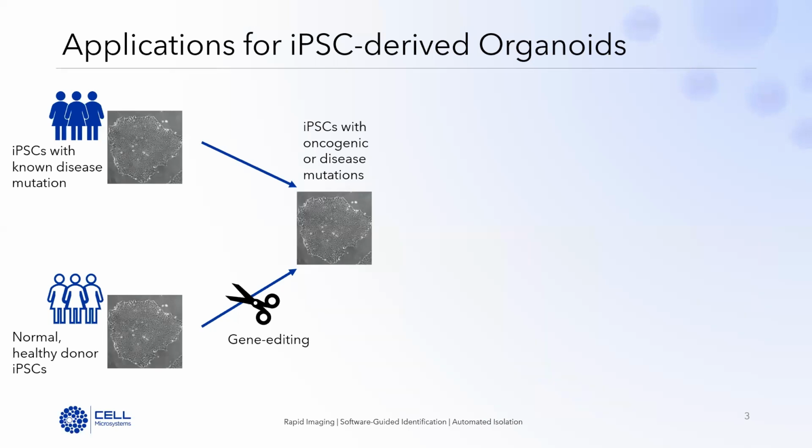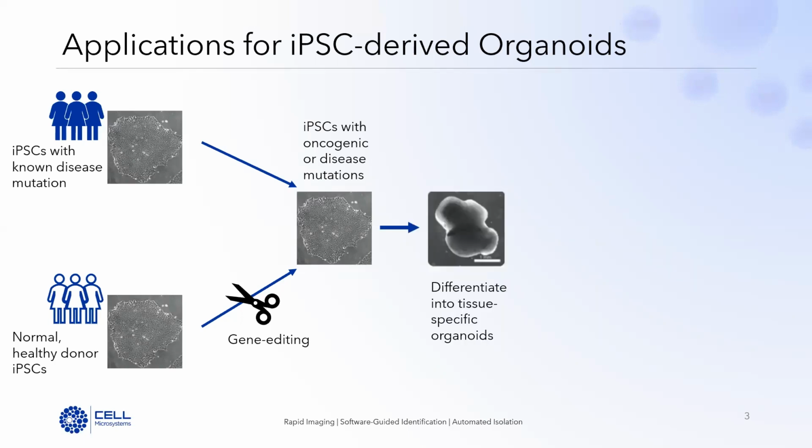With the advancements in iPSC technology as well as organoid technology, these iPSC cultures can be directed via growth factors that mimic the in vivo niche to self-organize and differentiate into organoids that mimic both the cellular and the structural complexities of tissues.